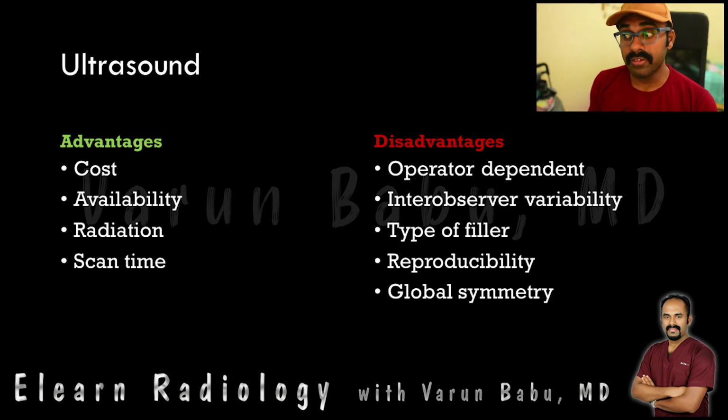It is difficult to reproduce the same scan findings, and it does not give us much of an idea about the global symmetry of distribution of the fillers.